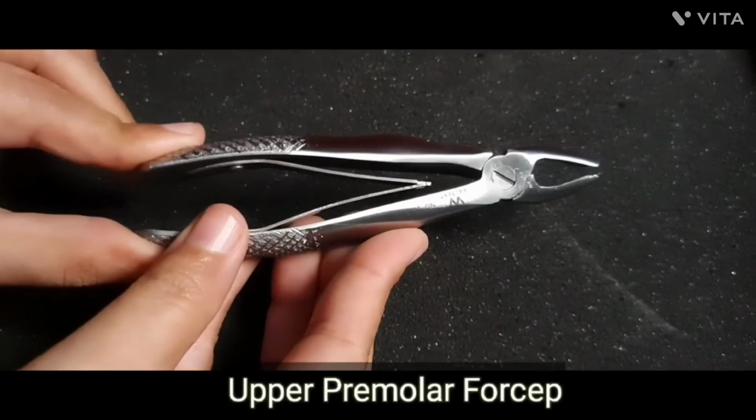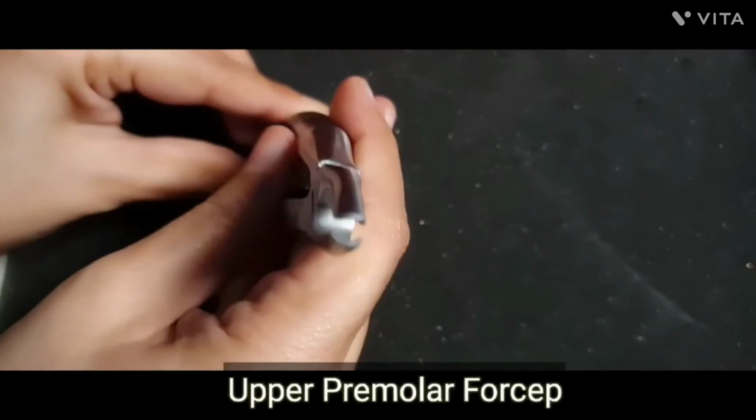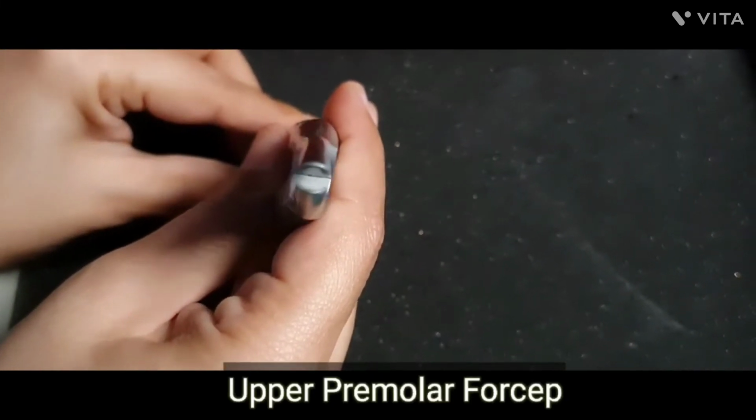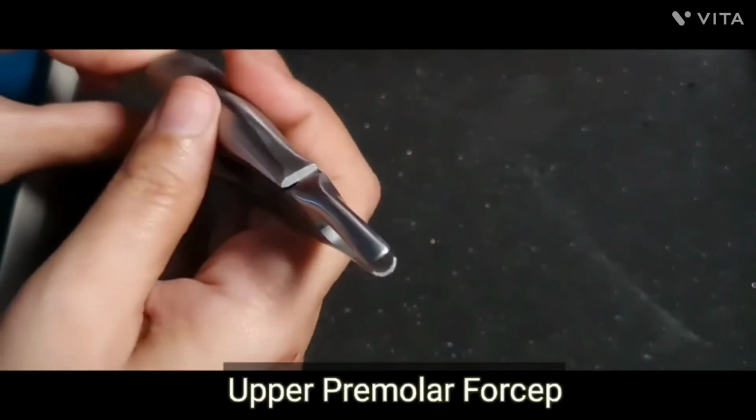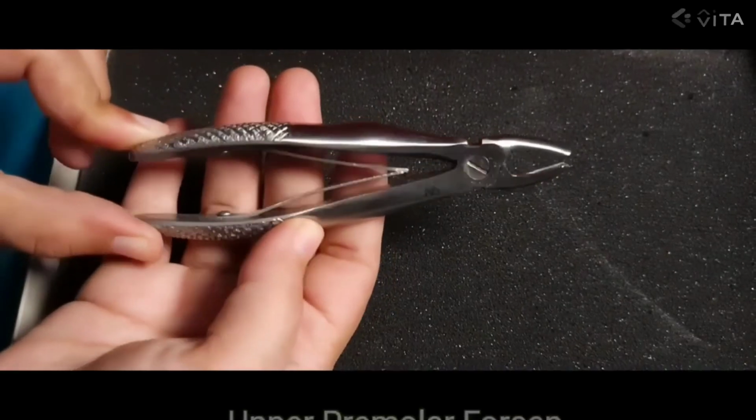This one we have upper premolar forceps. This is a little bit different from upper anterior, as the space is a bit more for premolar because of the size of the premolar. So it is used for upper premolar removal, which is removed by buccal expansion.